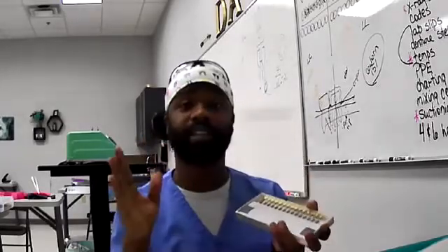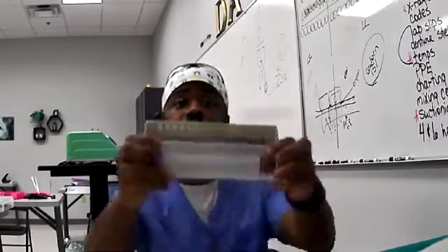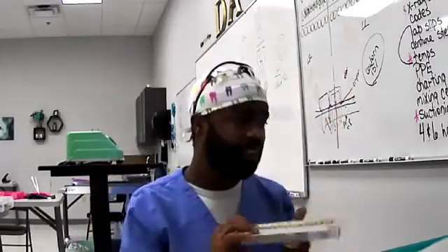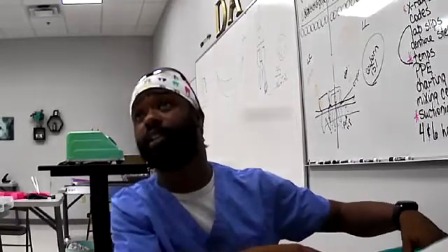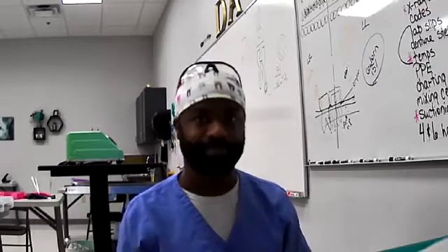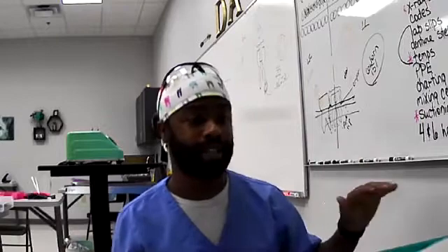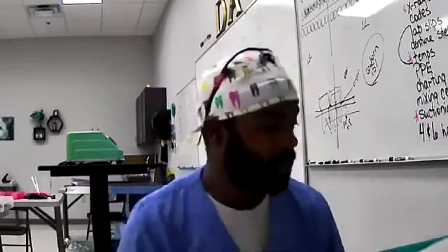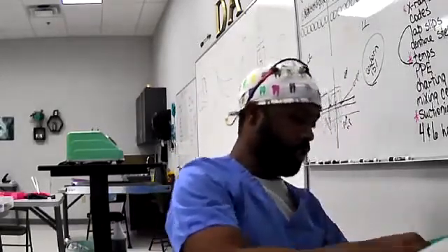If we're ever in class and I say set up for a composite restoration, I want to see this on every tray. Now, of course, with amalgam, you don't have to worry about the shade guide because amalgam is a silver filling. So it's literally going to be one color, silver. You don't have to worry about it. But any composite, check the shades.